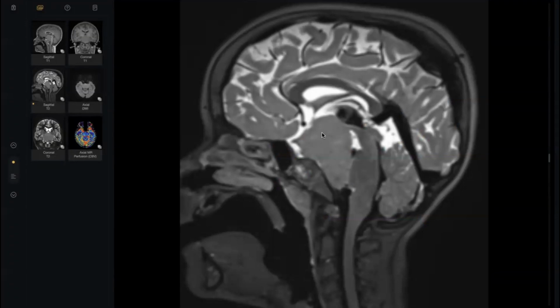Thank you, doctor. Thank you so much. My colleagues, this is a hypothalamic hamartoma. The most tricky thing here is the size. The size is too large. Frankly, when I saw it, I was thinking about glioma. It was my first differential diagnosis.